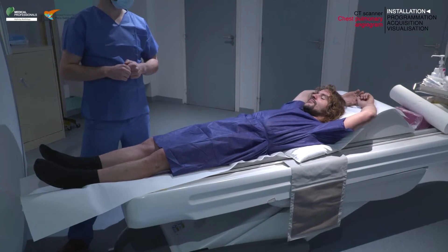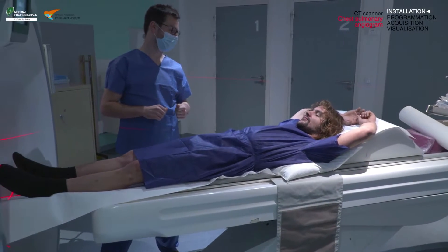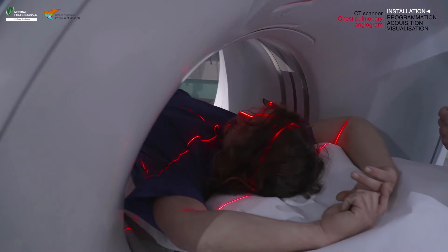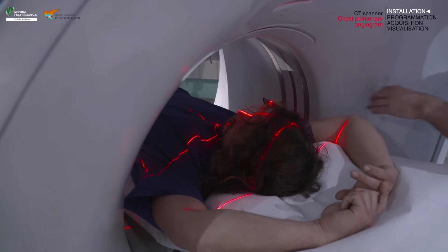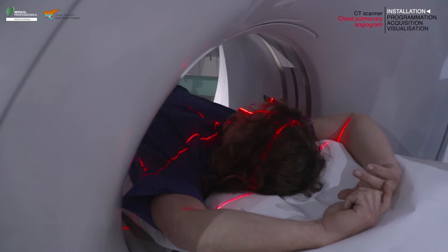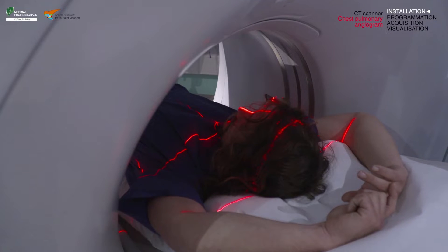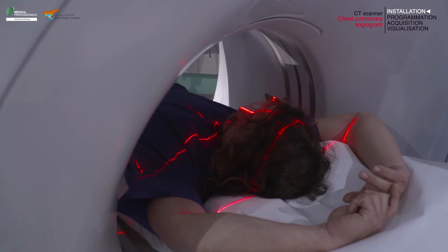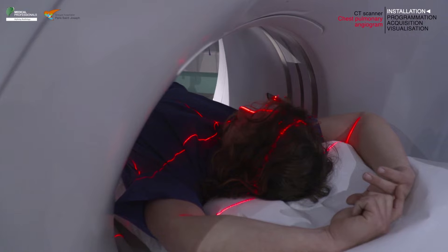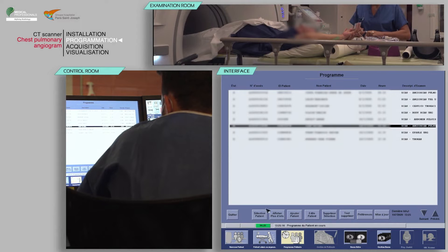This exam can be performed head first or feet first. Center the internal axial plane laser light on the appropriate landmark — here we use the jugular notch of the sternum. Make sure that the lateral laser light is set at mid-thickness of the chest and that the longitudinal laser light is placed on the median sagittal plane. Remember to close the doors of the examination room and perform proper hand hygiene, such as use of an alcohol-based hand sanitizer.